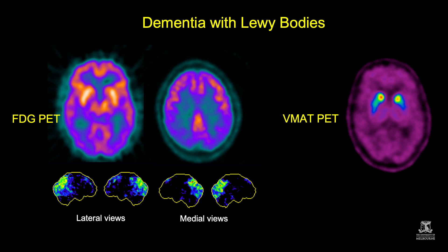This is a case of dementia with Lewy bodies, showing hypometabolism in not only the parietal cortex but also the occipital lobes, with sparing of the posterior cingulate gyrus visible in the middle image, and the VMAT-PET showing a reduction in putamen innervation.